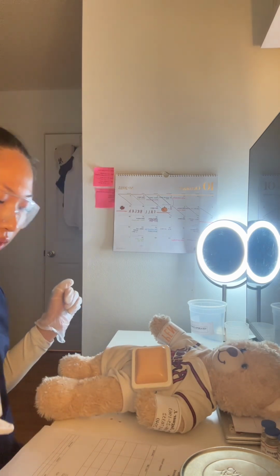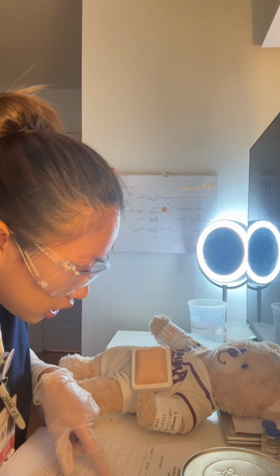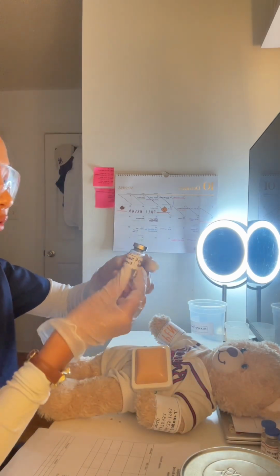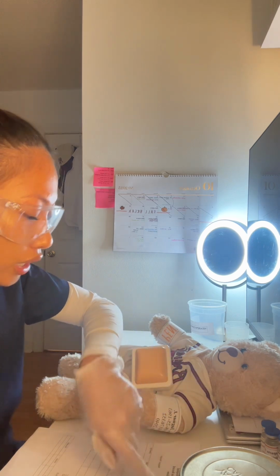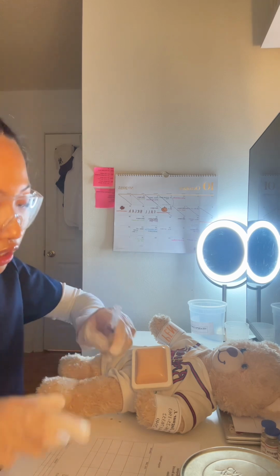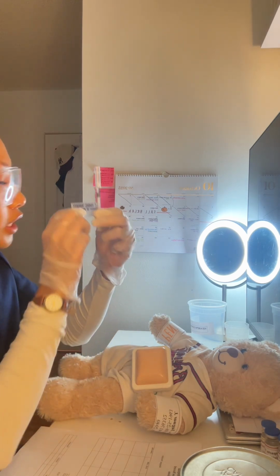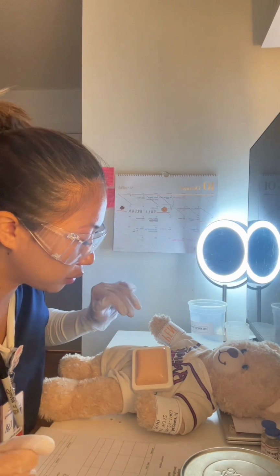Alright, Mr. Jones. Well, I'm gonna go ahead and see if I have the correct medication here. So I have Novolin R regular insulin, U100 insulin, and I do see that I did bring the Novolin R regular insulin, U100 insulin, and it is not expired as well. And I have Novolin R insulin in this syringe here, and I should have 10 units. Yep, I have written 10 units, and there is 10 units in the syringe. Right, and I will be giving this subcutaneously.